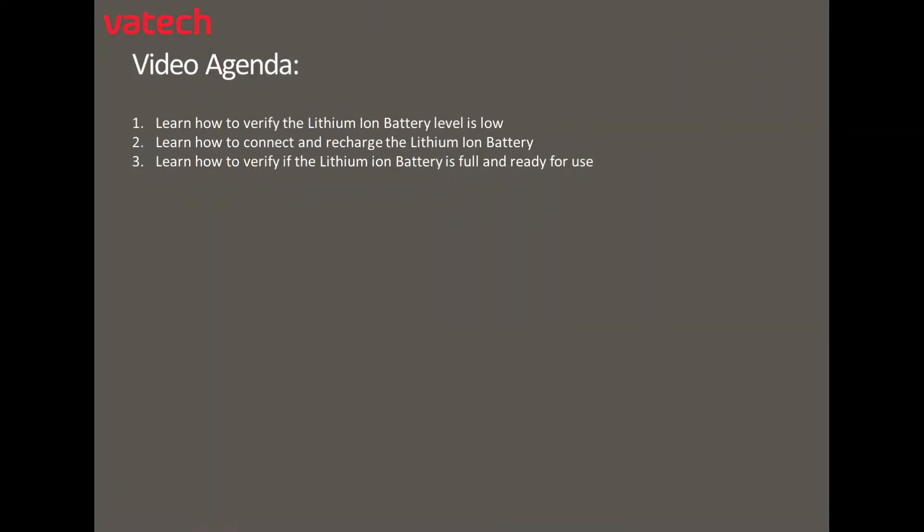Video Agenda: learn how to verify the lithium-ion battery is low, learn how to connect and recharge the lithium-ion battery, and learn how to verify the lithium-ion battery is full and ready for use.